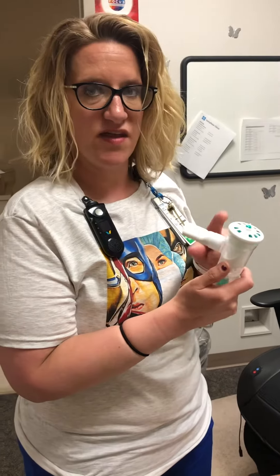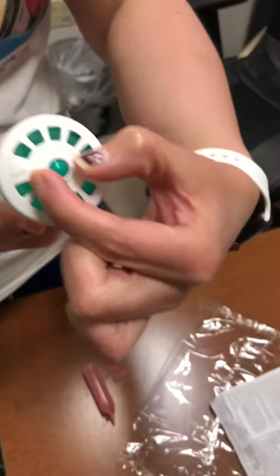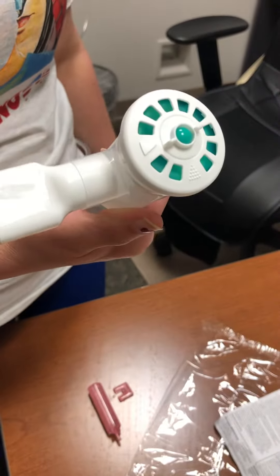Now if they cannot suck in, or they cannot make it nebulize, if you turn the top like that then it will go ahead and nebulize on its own. So then they can put it in their mouth and nebulize that way.